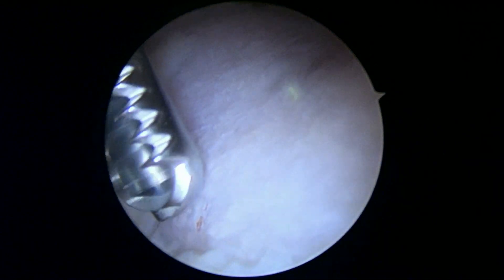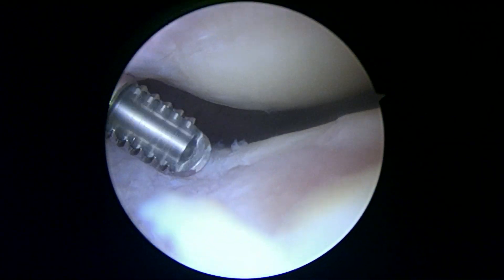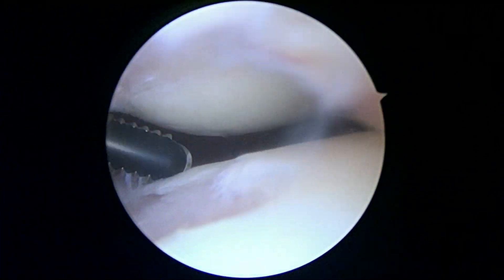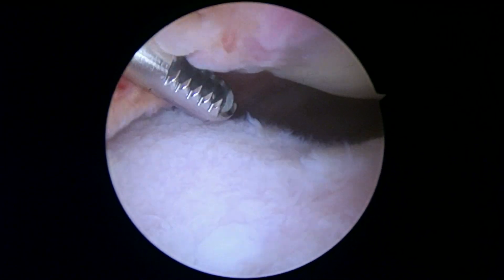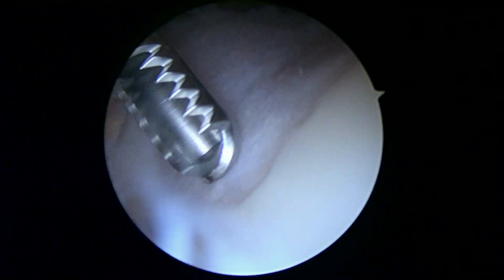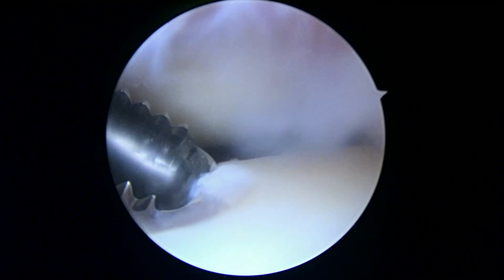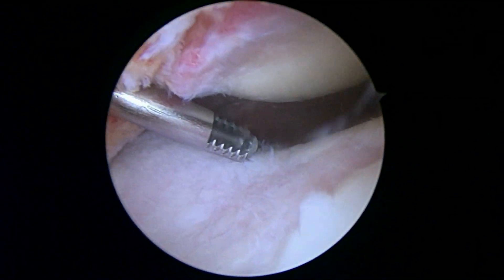You've lost a fair amount of cartilage. The normal cartilage is the white stuff. Where you've lost cartilage is where I'm touching — that's where you're missing it. So you've got a fair amount of arthritis in this knee. Hopefully we can buy you some time here with what we're doing today, and maybe with one of our biologic injections if you have symptoms. But that's certainly what we're seeing right now.